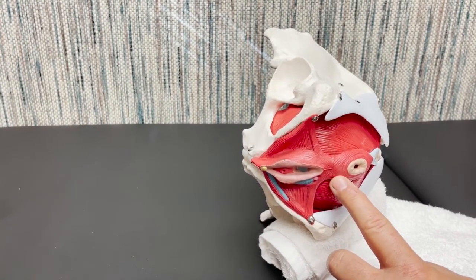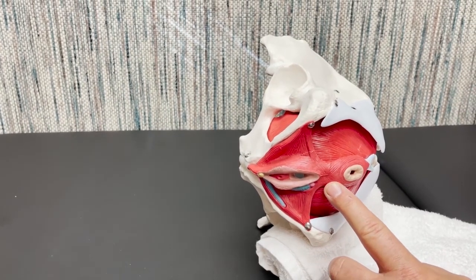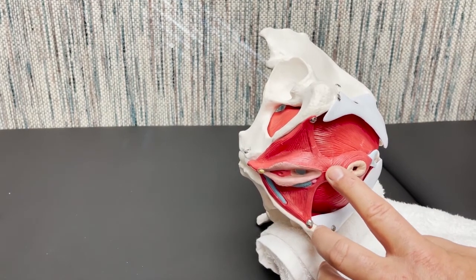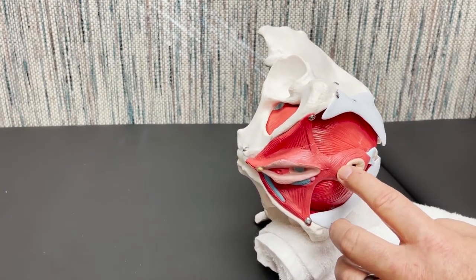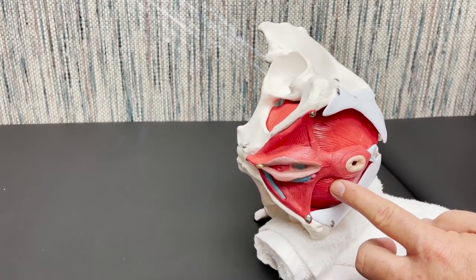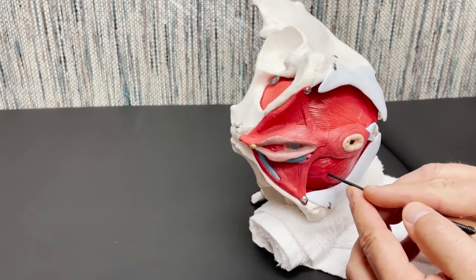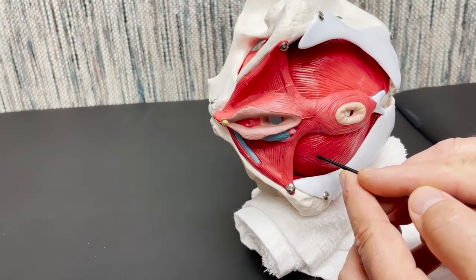We're going to needle 45 degrees both cranially and anteriorly relative to the treatment table. So ischial tuberosity, perineal body, anal sphincter, midpoint here. Then we're going to be 2 finger breadths, and then we're going to be 45 degrees both anteriorly and cranially.